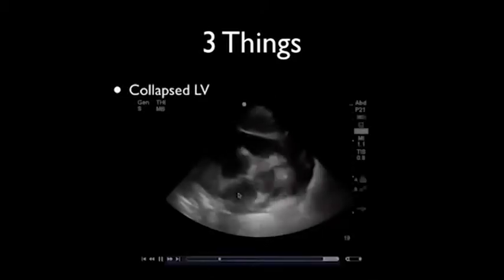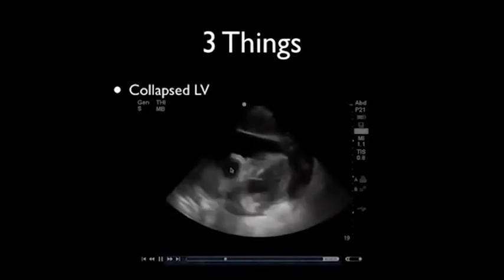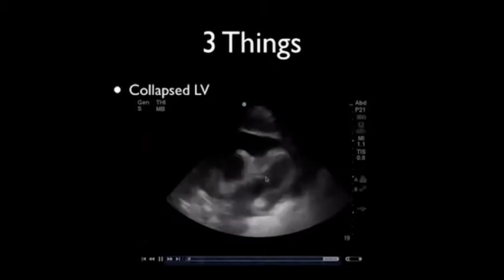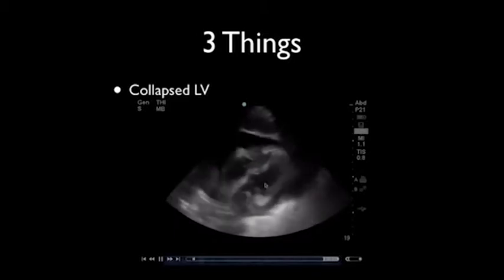The next thing we look for is the presence of a collapsed LV. So we think that if the patient has a reduction in forward flow because of collapsing of their right ventricle, the LV is therefore not filling. This makes the LV hyperdynamic, meaning that the walls touch during systole. So this patient, for example, has an ejection fraction of approximately 100% because the LV walls are touching during systole. This is because the LV is not filling appropriately because of the lack of forward flow coming from the right side of the heart.